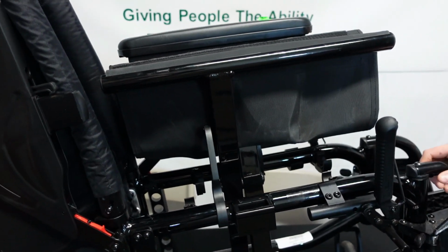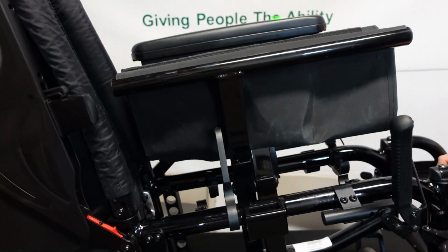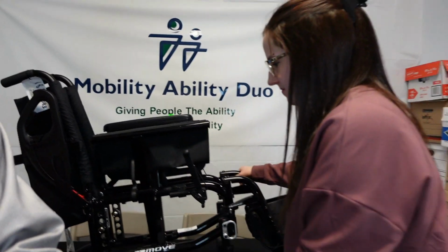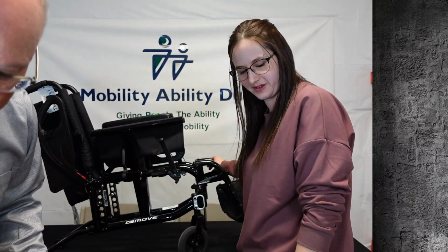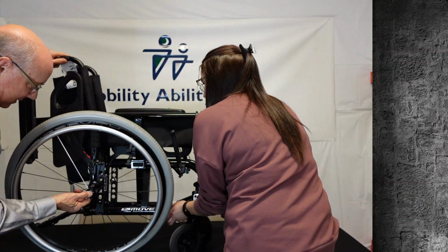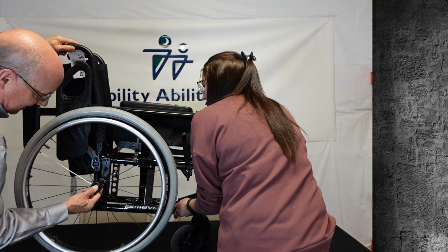Why don't we put the wheels back on and put the camera back, and let's try this. Let's give it a go. This is going to be good. I'm excited.